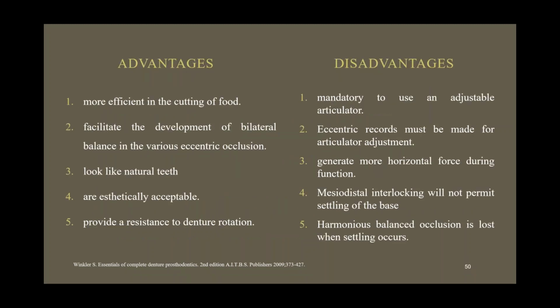Anatomic teeth are more efficient in cutting food, and they also help facilitate the development of bilateral balanced occlusion. They look like natural teeth, so they are more aesthetically pleasing, and they also provide resistance to denture rotation due to their interlocking.